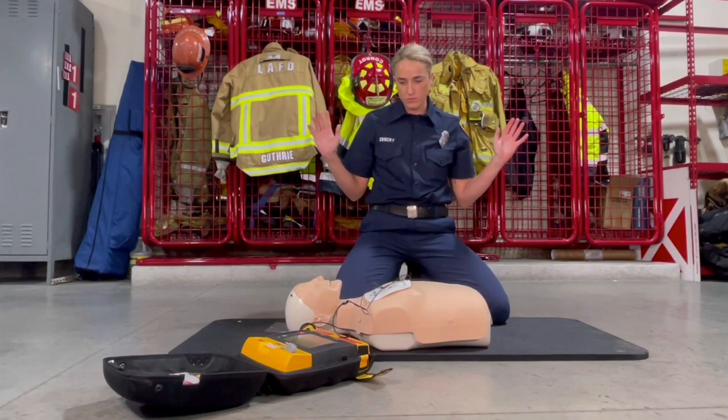If the AED tells you to deliver a shock, push the shock button.